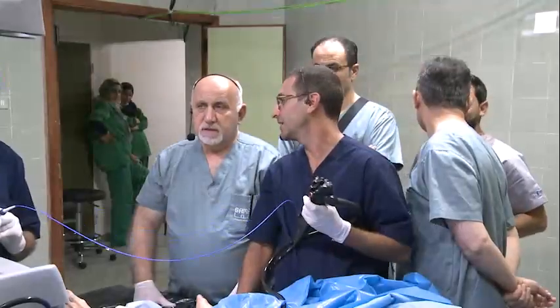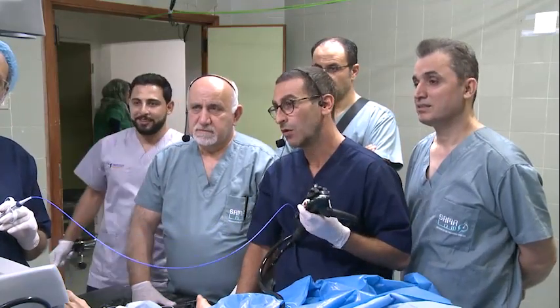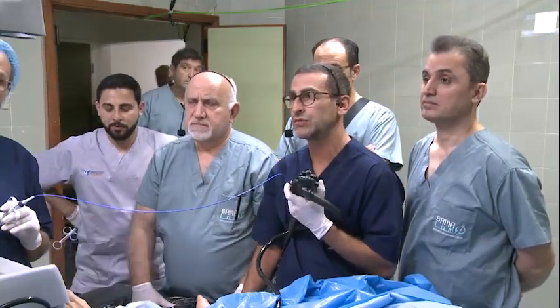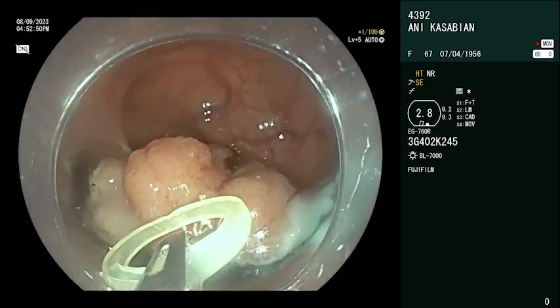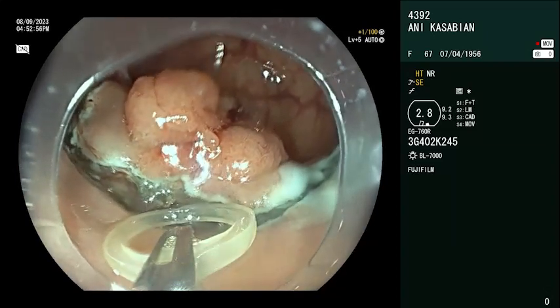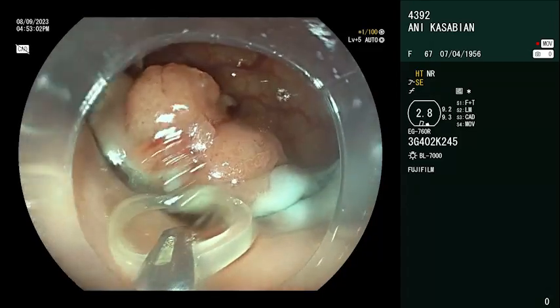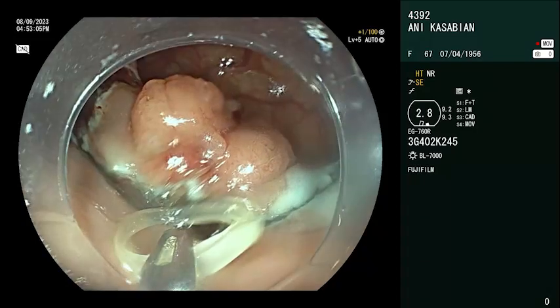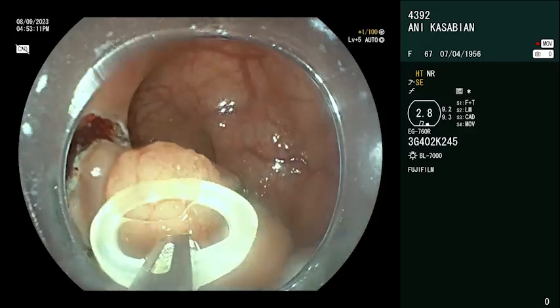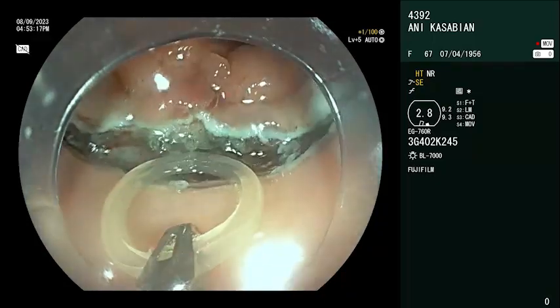Okay. Hi again, everybody. We are very happy to work here together. And this is a case of a rectal lateral spreading tumor, granular type. We performed the circumferential incision of the lesion. We analyzed the lesion. There is a fibrotic area just in front of us. That's why there are biopsies, previous EMR. But I will show you that using this traction, perhaps we can make this part easier.